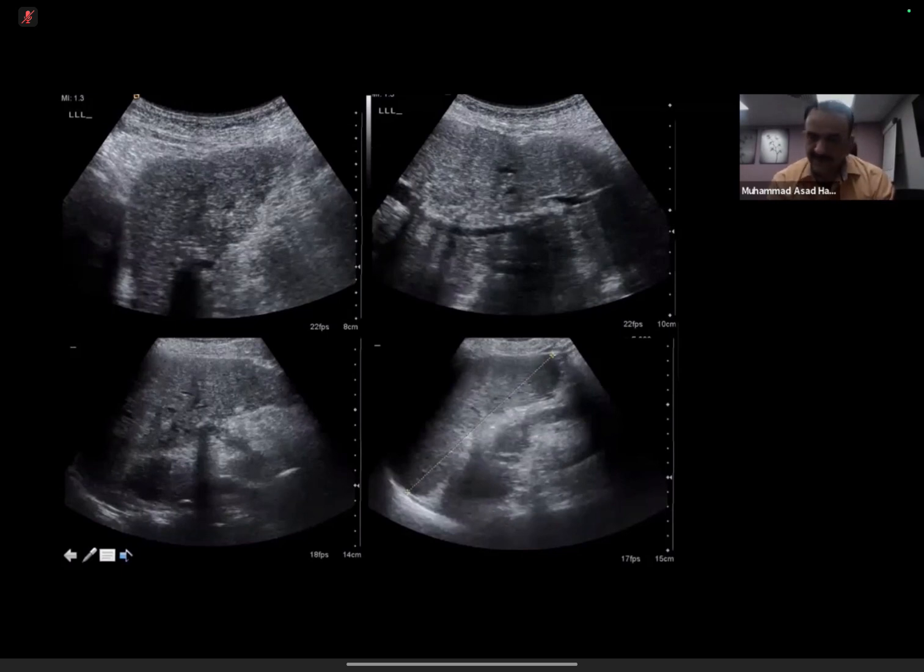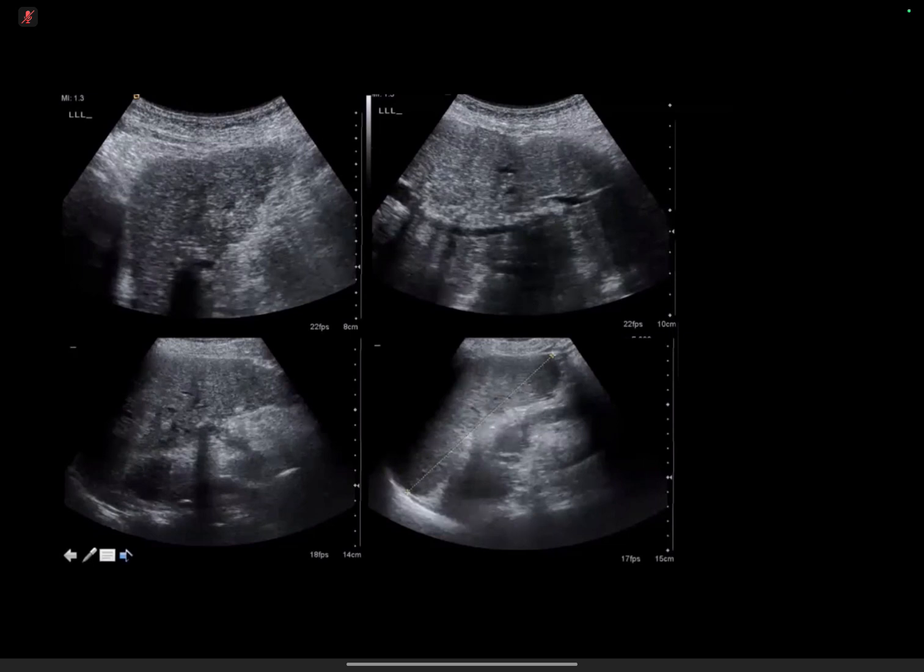The reason for recommending a transjugular biopsy is that you're going through the vessel into the liver parenchyma. Unless you have passed a very big needle and breached the liver parenchyma, you are basically just connecting the blood vessel to the liver parenchyma. So these patients do not bleed.